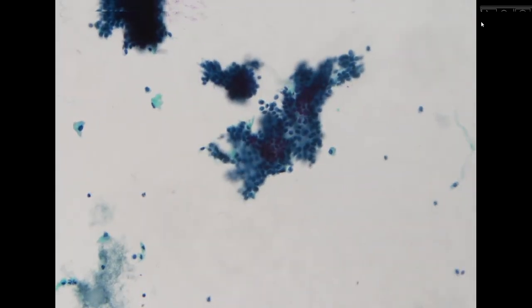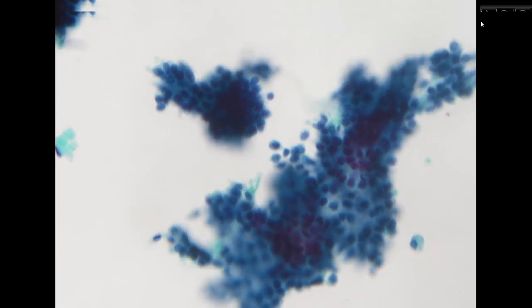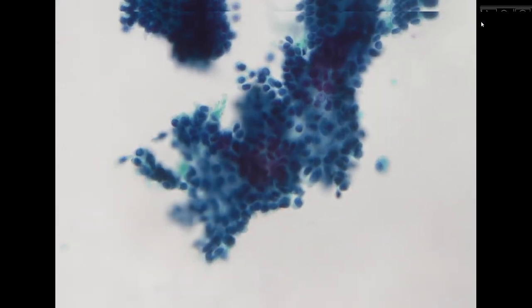When we see these types of cellular changes, we consider, could it be basal cells or basaloid cells, or could it just be myoepithelial cells with a more prominent basaloid feature?